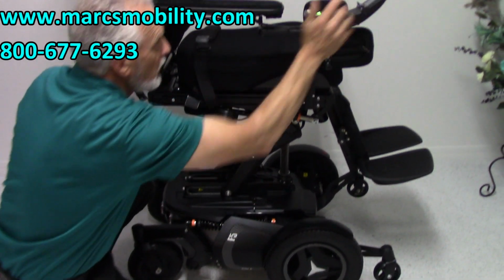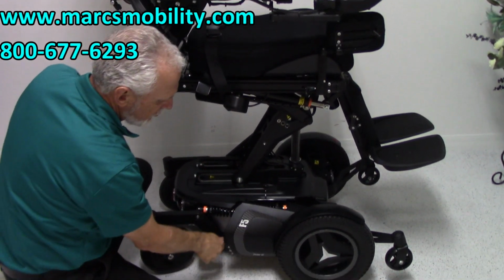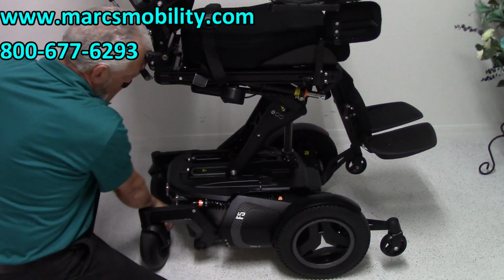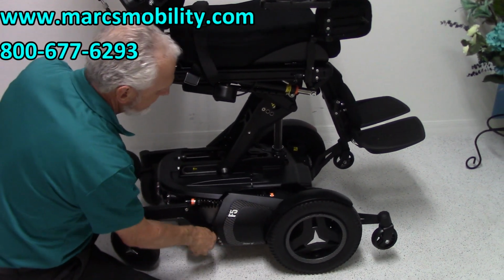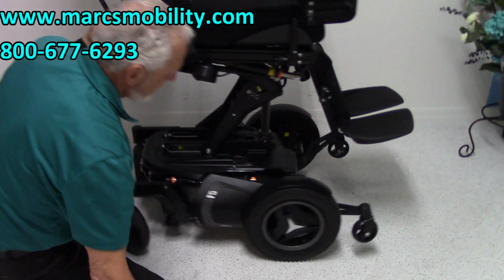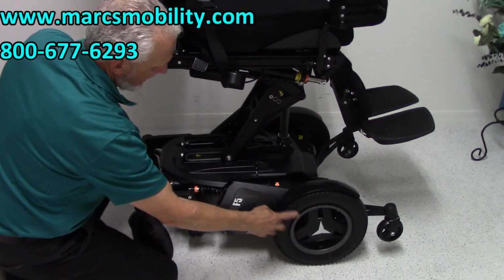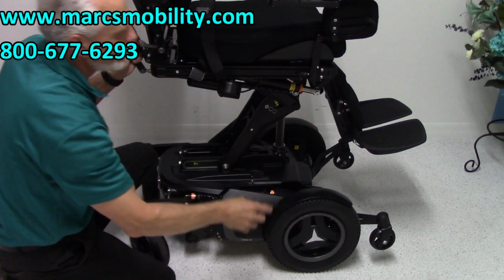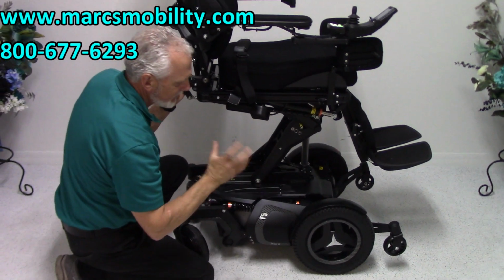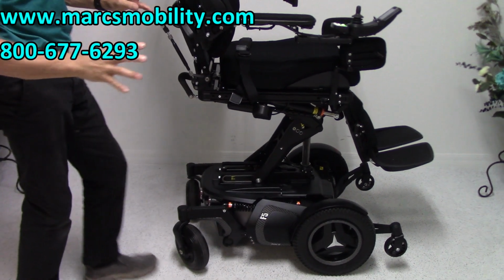But if you turn the power off on your chair, bring the seat down, of course, put it in neutral, both motors on both sides, all of a sudden, if I turn this wheel here, you'll be in neutral, as you can see right there. So the wheel's in neutral. Put it back in gear, and you're back in gear, then turn your power back on. The reason you want the power off is because when you leave the power on, it'll give you some resistance in the motors. So you don't want to have any resistance when you're pushing this chair.